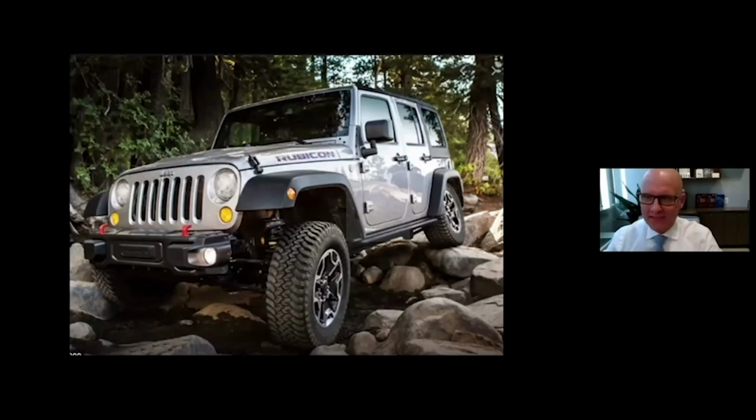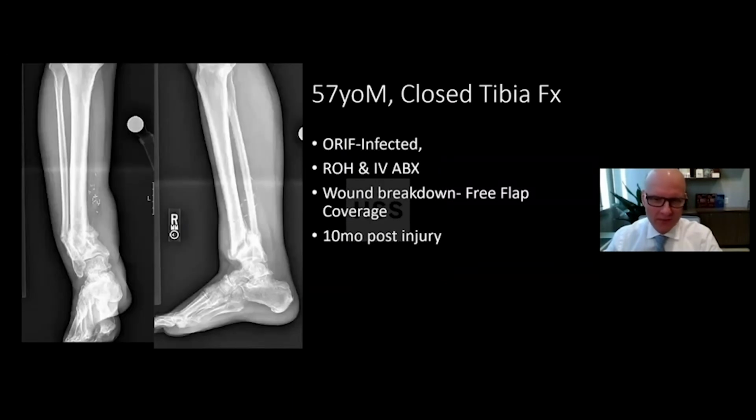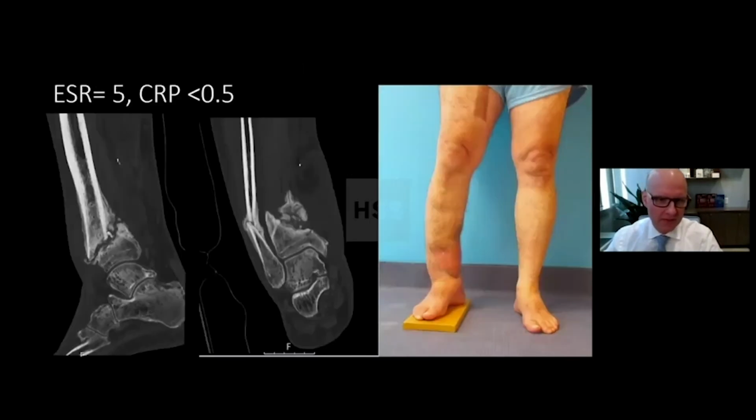Well, let's take this thing a little more off-road and see what else we could do with it. So my second case was pulling through a hypertrophic non-union of the tibia. Here's a patient, hypertrophic distal tibial non-union, history of infection. He had a free flap after a wound breakdown. Here he is 10 months post-injury.